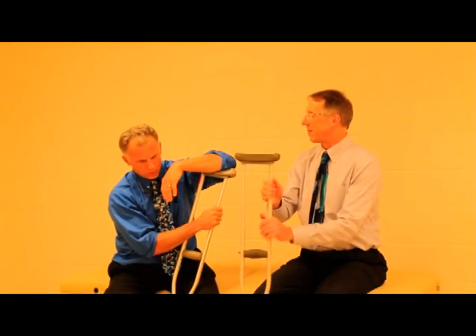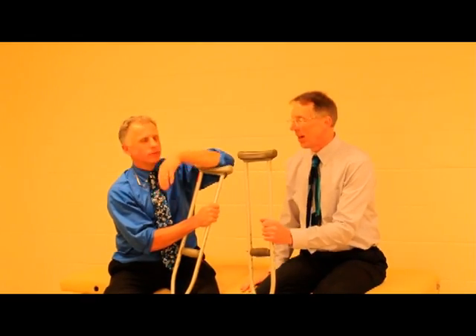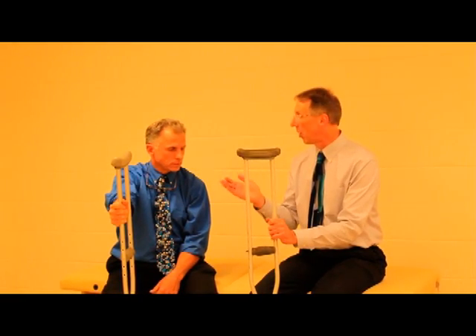Okay, I'm Bob, you're Brad. Right. So today we're going to show you how to fit crutches. This is very simple but you need to know how to do it, because if you do it wrong you can actually end up hurting yourself.